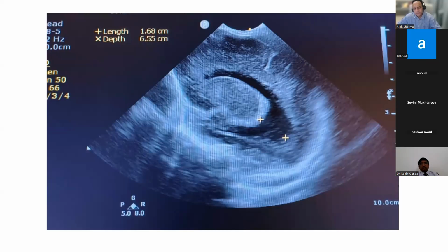So, a little bit hyperechoic. Yeah, I think when I look at some areas here, in particular this area, looks a little bit hyperechoic. Some of this might reflect your high gain settings, but this area does look a little bit hyperechoic. But the ventricles look clean. You've got a bulky choroid. Again, a very nice image, but very poor sulcal gyral maturation. A very smooth brain.